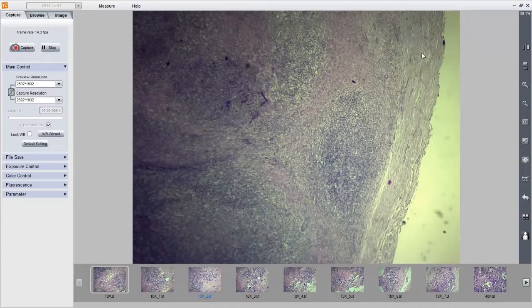It appears to be thickened, right? So one of the features of Hodgkin lymphoma is a thickened capsule. So when do you get a thick capsule? A thick capsule usually forms when there is chronic involvement of a lymph node, in a low-grade lymphoma, in a Hodgkin lymphoma, or even a non-neoplastic chronic disease involving the lymph node.